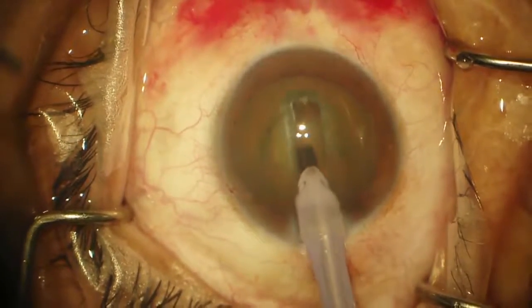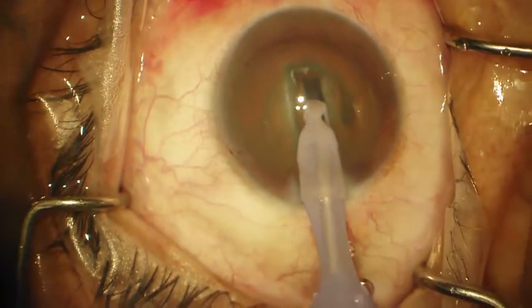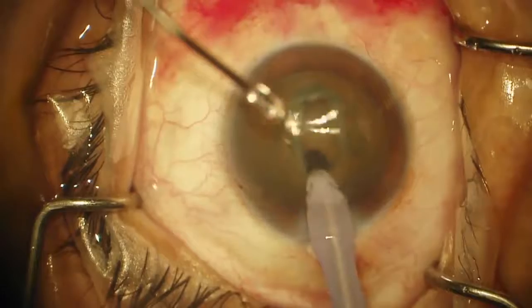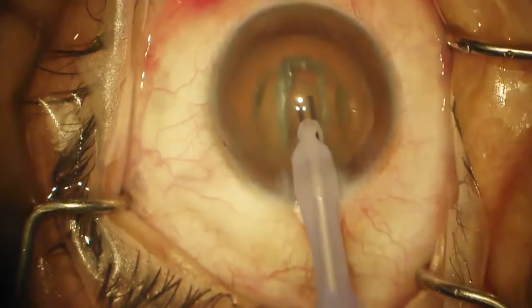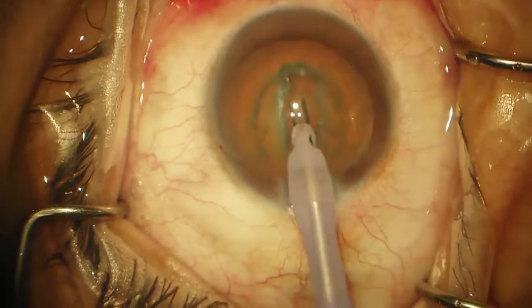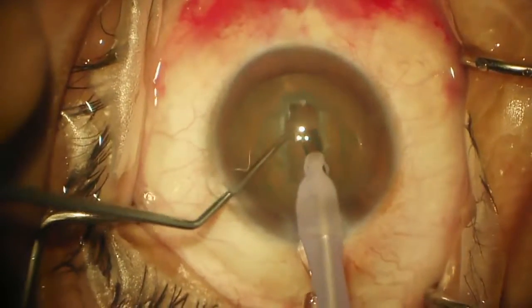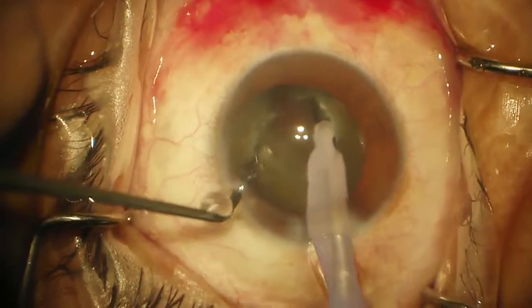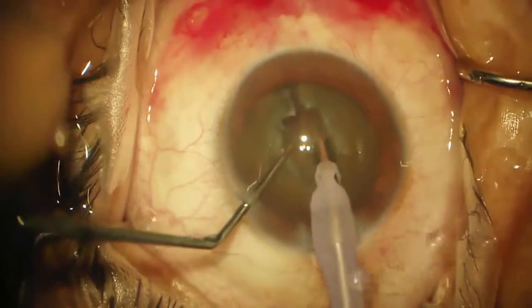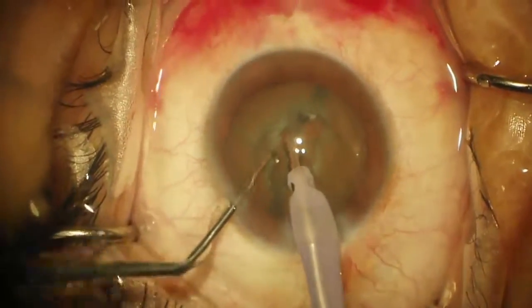The oscillatory motion is at 100% but only when I go all the way to the bottom of foot position three, and I don't do that very often unless it's a very hard lens. You can see I'm probably about three and a half phaco tip depths and I'm just on irrigation only — no aspiration. I'll put my second instrument in through the side port, go to the base, and then it breaks very easily — I've got a crack all the way through.